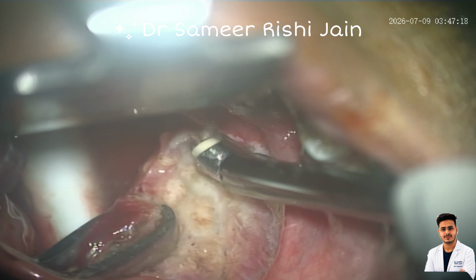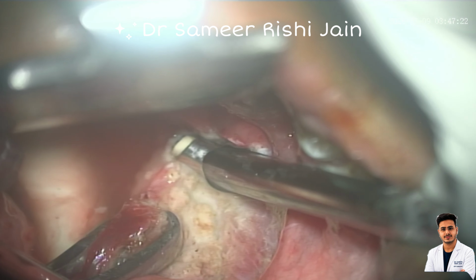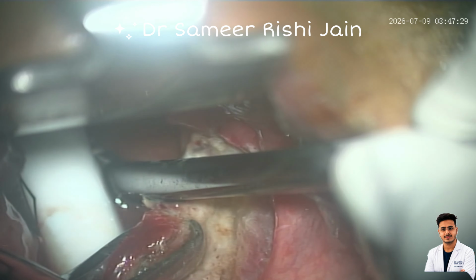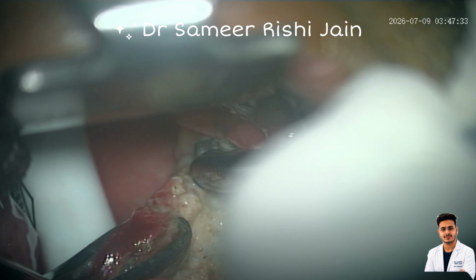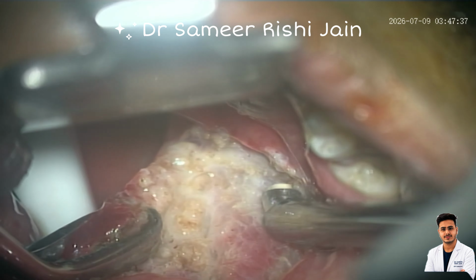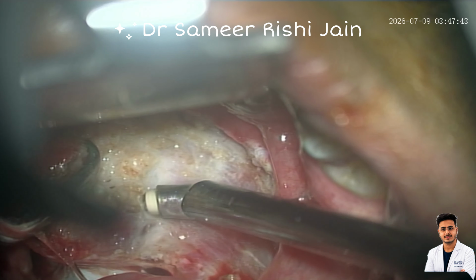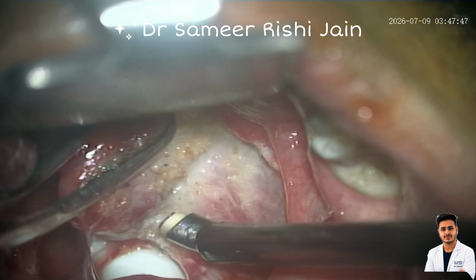The tissue at the lower pole is more adherent to the tonsillar bed and it is a little difficult to separate the tissue from the bed. And in a case of chronic tonsillitis where there is repeated infection, the tonsils are fibrosed and it is difficult to find the correct plane of dissection. But once you find the correct plane of dissection, the tonsillectomy procedure is a very easy procedure and it can be done within a few minutes.